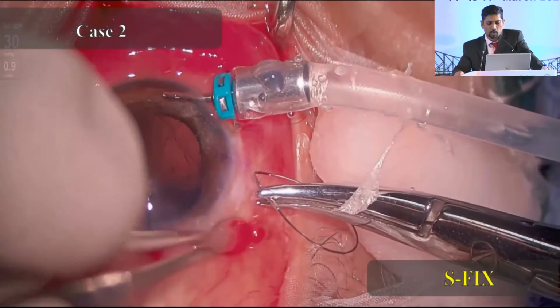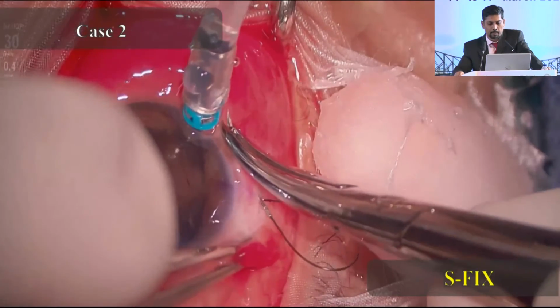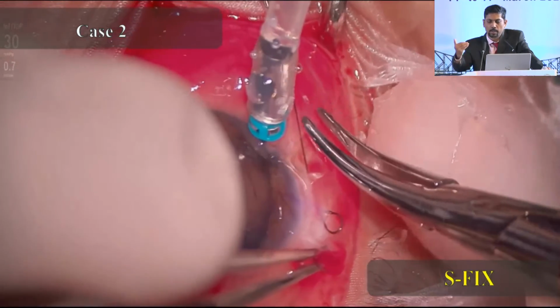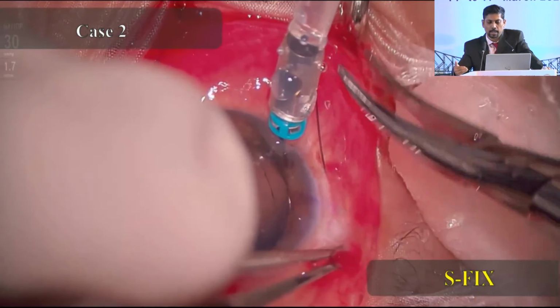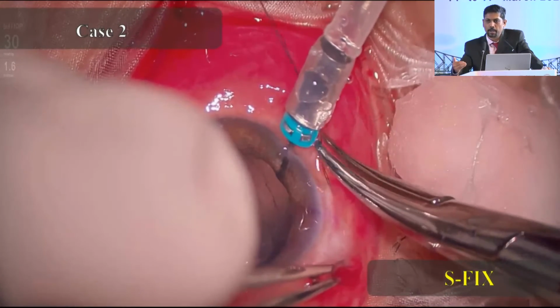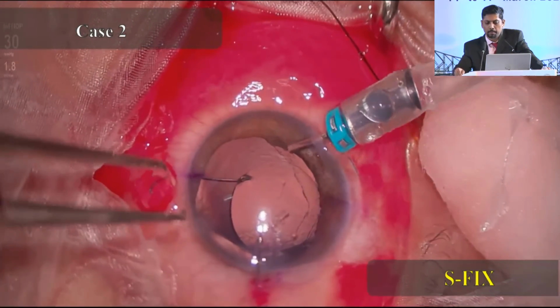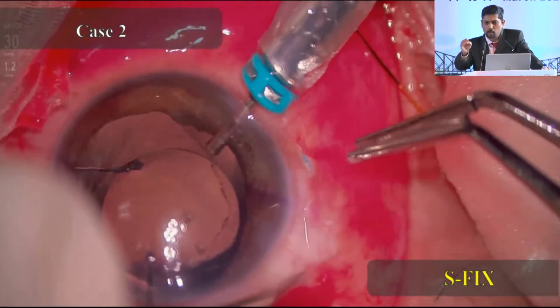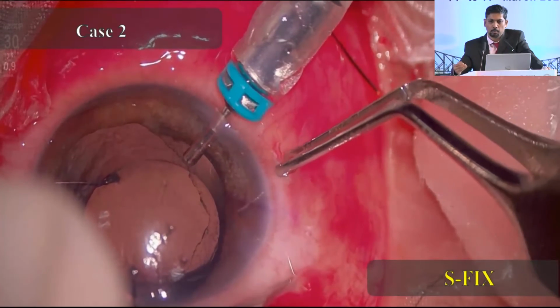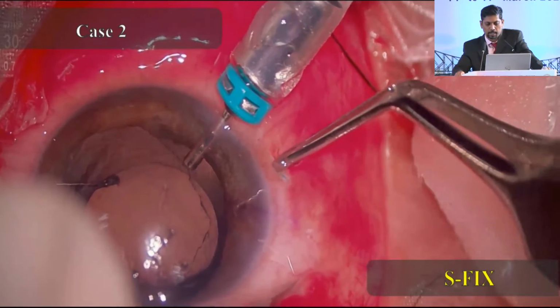So now you can see the suture bite is done, and you retrieve it. S-Fix has 3 components. One is a 380 micron spatulated needle connected to a 5/0 nylon suture, and we have incorporated an 8 mm polyamide tube. So some amount of haptic, sometimes you will see it's actually good. You can actually push it inside. You can take advantage out of it. You can push, pull, and center the IOL at the end. So as you can see here, I am pushing it.